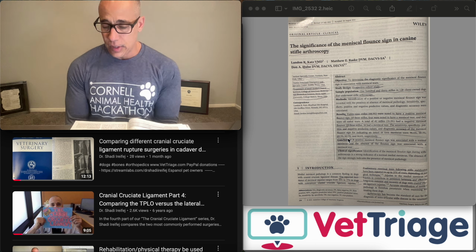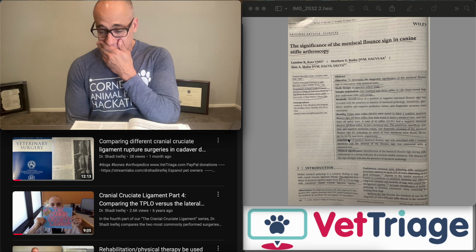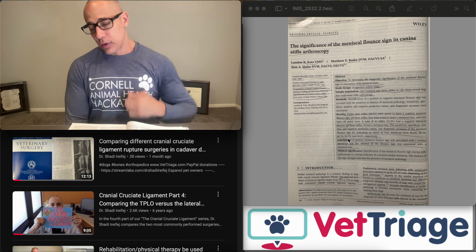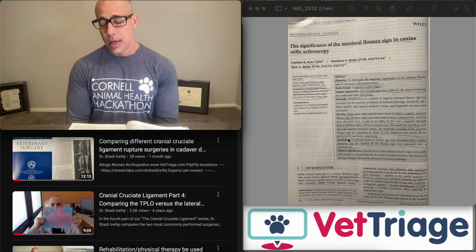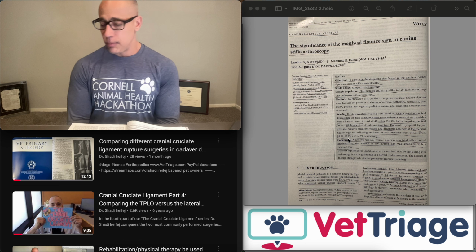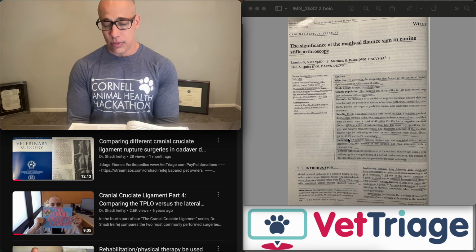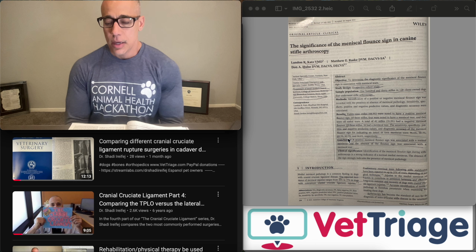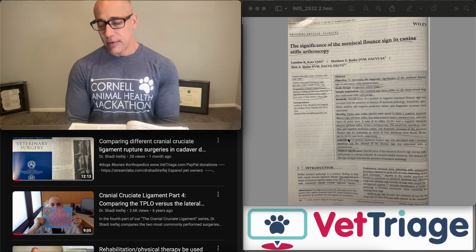So limitations of the study was you need more dogs. Also, I would argue that having an MRI as a secondary test. MRI is also minimally invasive, although it requires general anesthesia, but so does arthroscopy. MRI does not require any penetration into the stifle joint. So it may be that a good test to run as a secondary, confirmatory diagnostic in the same dogs that also get the scoping would be to have an MRI done as well.